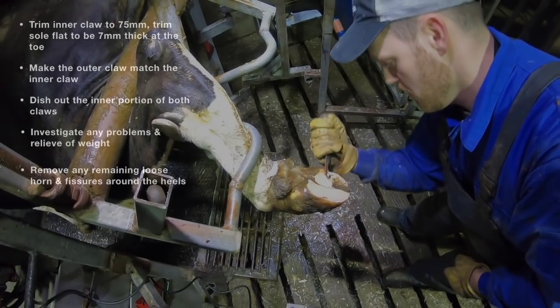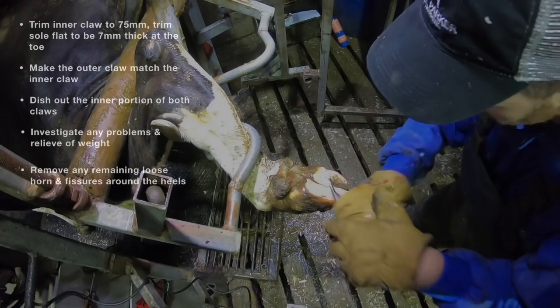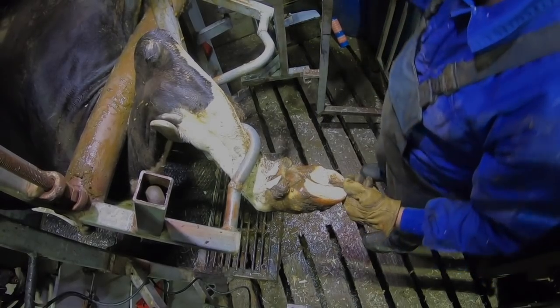There's a little one on that inside claw there, so you can see me just dishing that out. After that, remove any remaining loose horn and fissures around the heels. And you're done — perfect routine trimming.